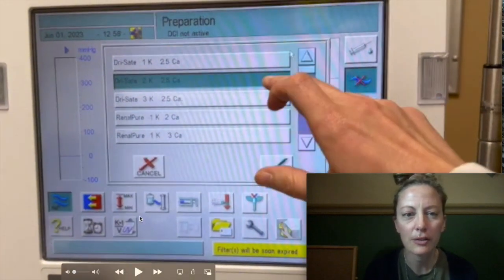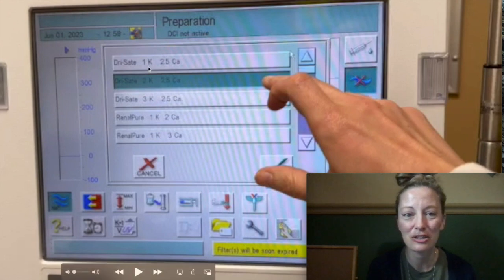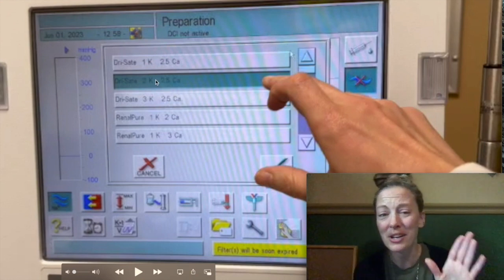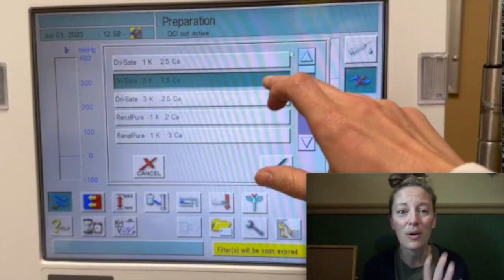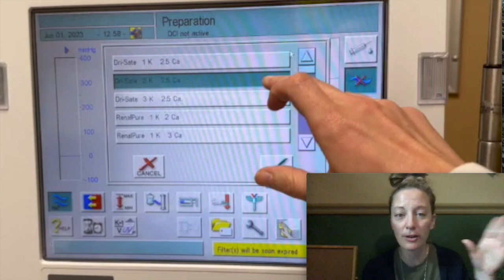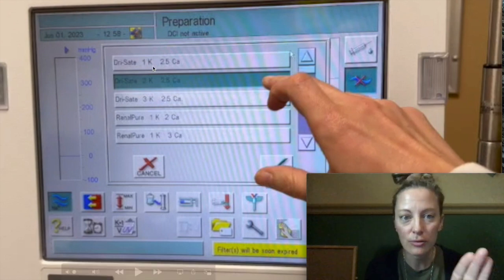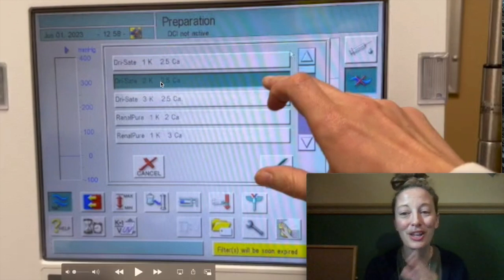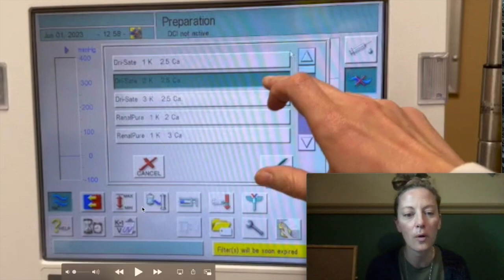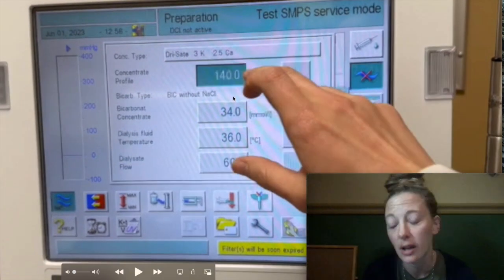We can choose what dialysate bath we're using. And when we're new, we think it sounds like the machine is making that dialysate and has control over what the recipe is — what is in our dialysate. It can make a 2K, a 2 potassium, or it can make a 3 potassium bath. And that just is not true. A lot of the mistakes I see with this is we choose the right bath on this machine, but then we don't have the right bath actually where the wand is. That is the feature that I would remove. Next is the concentrate profile — oh my God, another name for conductivity.